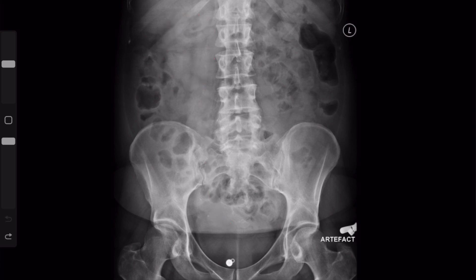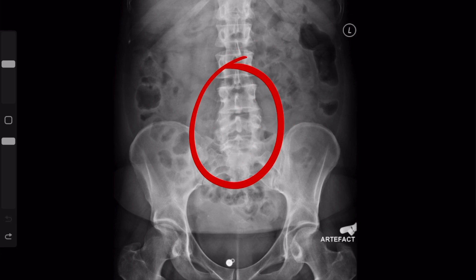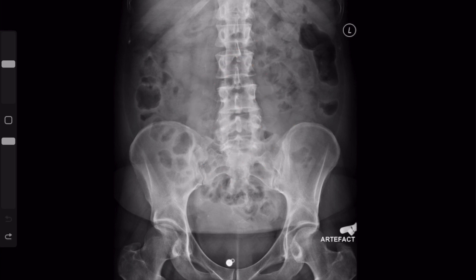In this case, I do not see renal stones. I then get a general idea of the distribution of the bowel loops — sometimes there can be a large mass that pushes the bowel loops a certain way, or the loops are concentrated centrally because of ascites. Always keep in mind pneumoperitoneum, or evidence of free air — that's one of the big things you don't want to miss on a radiograph. And that is my approach to the abdominal radiograph.